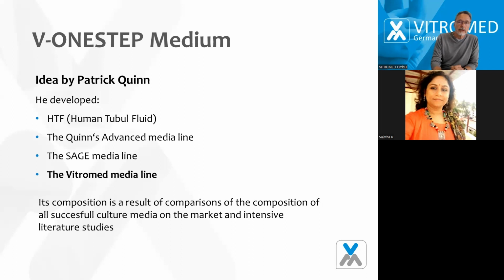But blastocyst culture was not possible. It was just possible to culture the embryos until day 3. Then he developed two further media lines, a complete media line with everything you need: washing medium, sperm preparation medium, cryo media, and a second one, the SAGE media line. I think a lot of you know this media line.